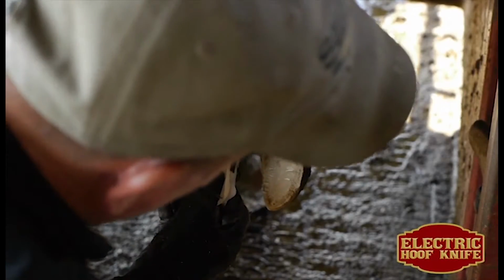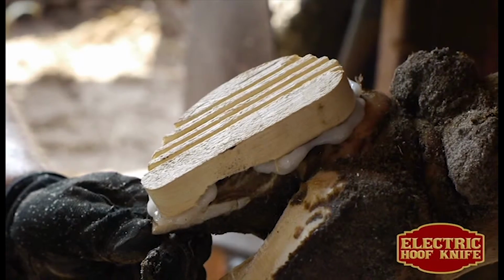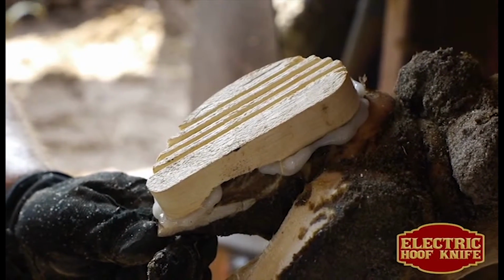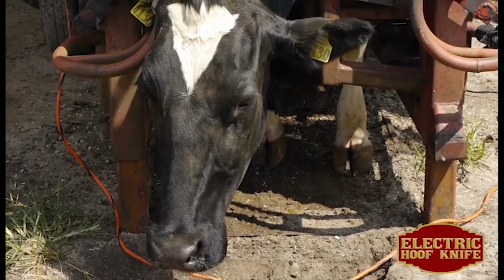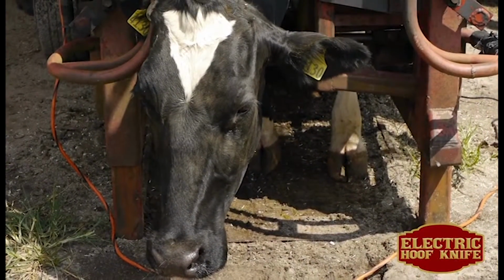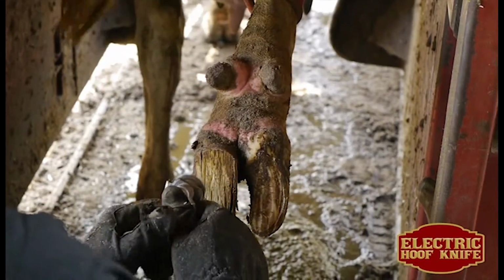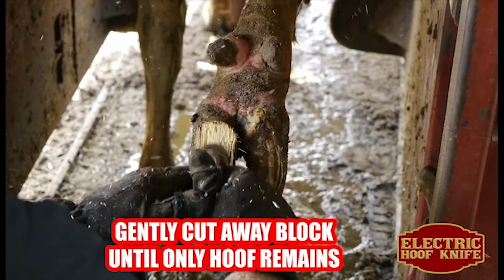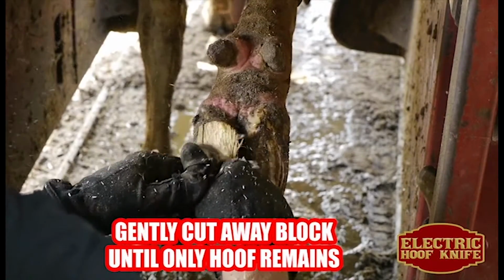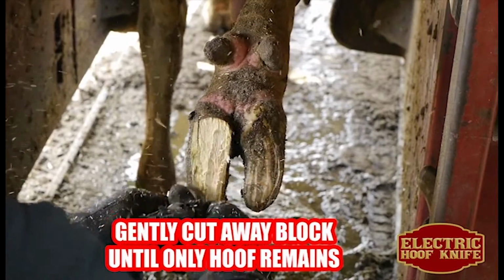If you were required to remove a lot of hoof to treat the problem, we recommend you use an antibiotic ointment and a bandage wrap to protect the hoof from further infection. This will keep the hoof clean and allow it to heal. After 3 to 5 days, you can cut the bandage off. You can also use the electric hoof knife to remove a block and its glue from the hoof by running the disc over the wood and shaving off the block until only the clean, healed hoof remains.